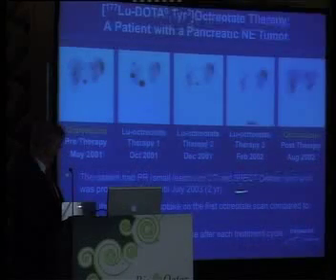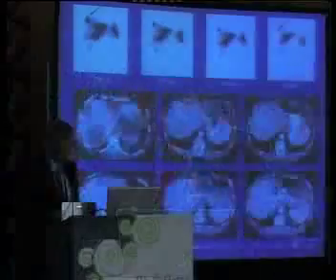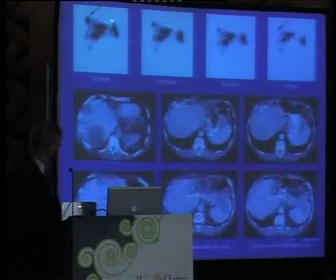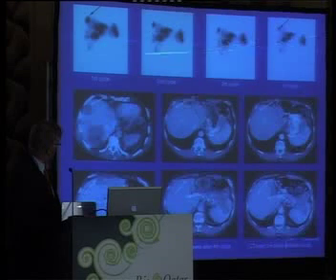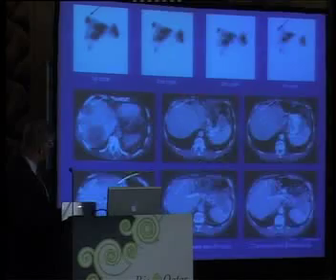be a responder. You see here the octreoscan after the last dose, huge difference, but by performing SPECT and CT, there were still small lesions. So this patient had a partial response, not a complete remission. Here another case, again the post-treatment scans after 4 cycles. Here you see the CT at baseline, the CT 6 weeks after the fourth treatment, and this one 3 months, and over time, fantastic tumor shrinkage in this patient.